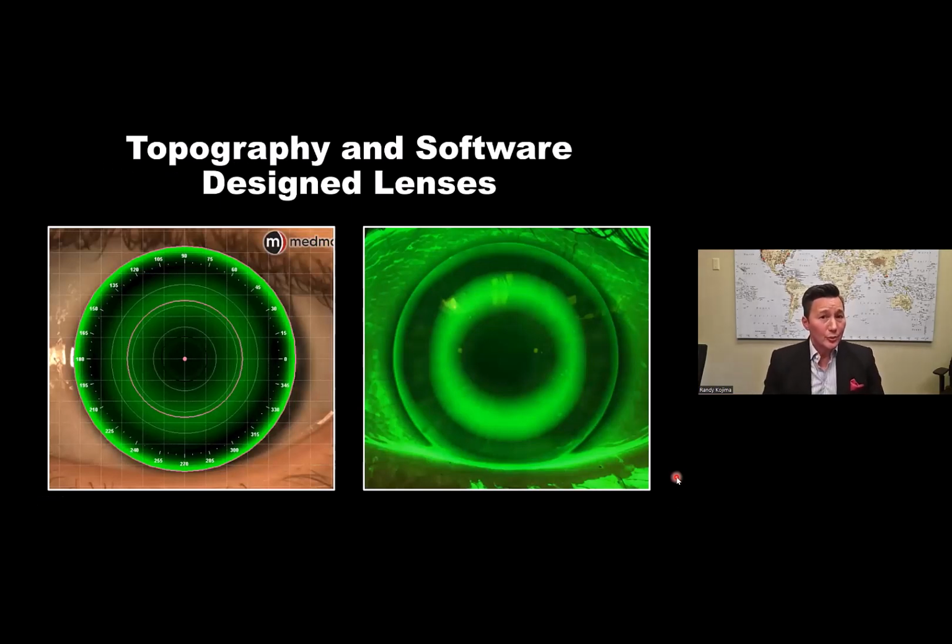Now, you could manufacture your own, you could construct your own very customized ortho-k lens. But what makes this marriage of software and lens together so great is that you have an efficient way of calculating a highly customized lens. So while we teach our contact lens resident every year how to build an ortho-k lens, we want them to understand the construction of all of the specialty lenses.